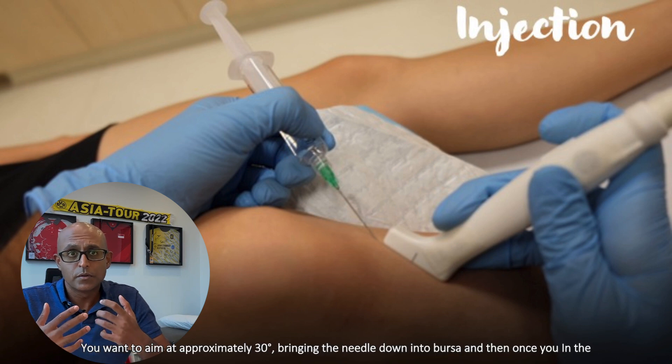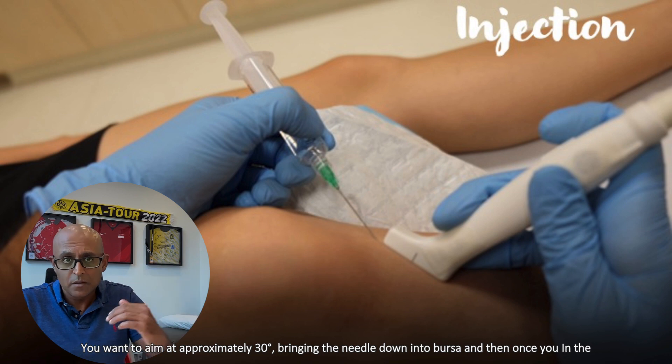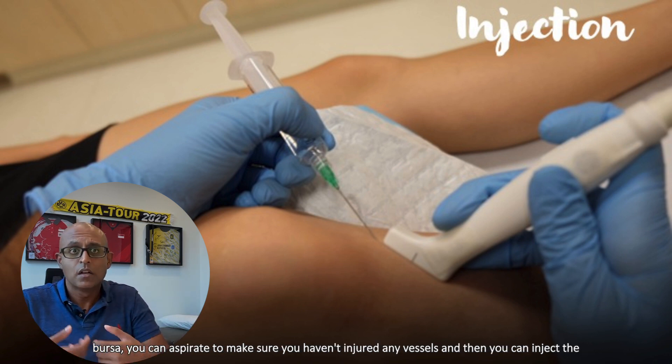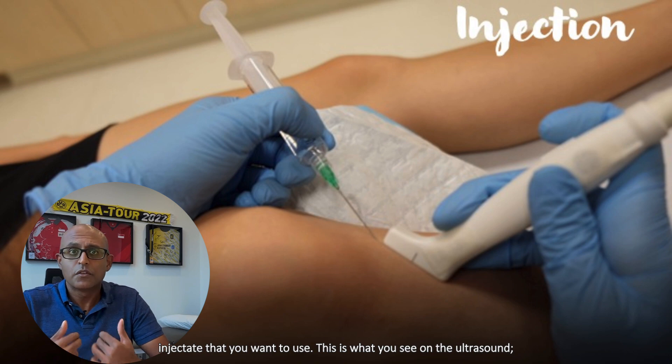You want to aim at approximately 30 degrees, bringing the needle down into the Bursa, and then once you're in the Bursa, you can aspirate to make sure you haven't injured any vessels, and then you can inject the injectate that you want to use.